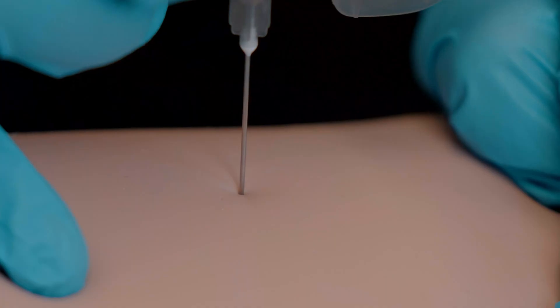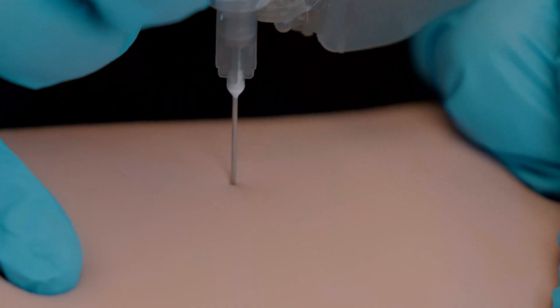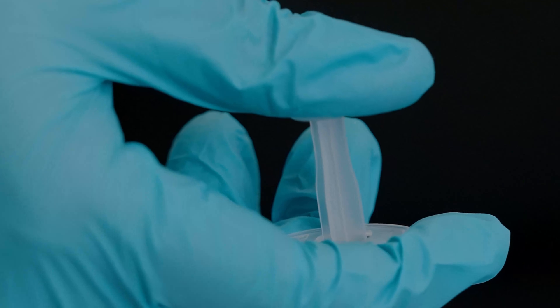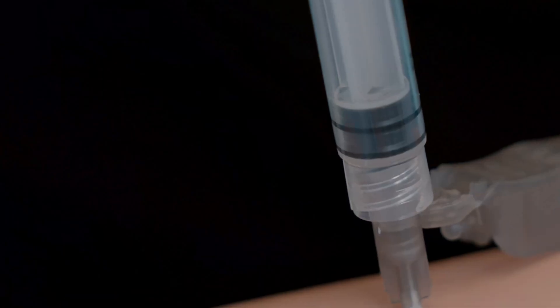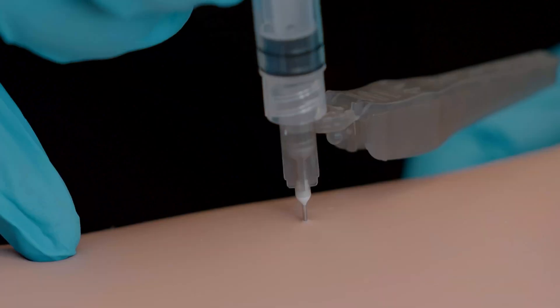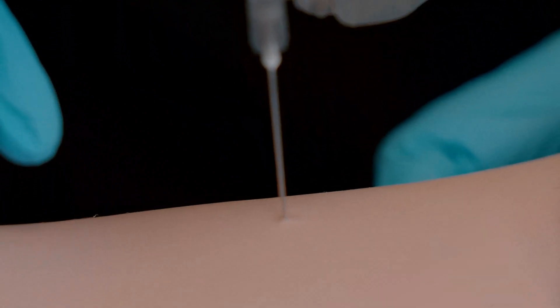Once you are satisfied with the placement, you are ready to proceed. Inject the medication slowly at the rate of 1 milliliter every 10 seconds. Wait for 10 seconds and then smoothly withdraw the needle and engage the needle safety.